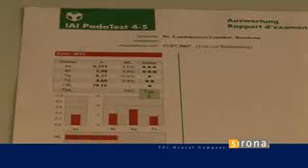Today, we will be performing a periodontitis treatment on a 50-year-old patient. We carried out 2 professional tooth cleaning procedures within the scope of pre-treatment. A bacterial test was carried out at the same time. Based on the test result, aggressive periodontitis was suspected.